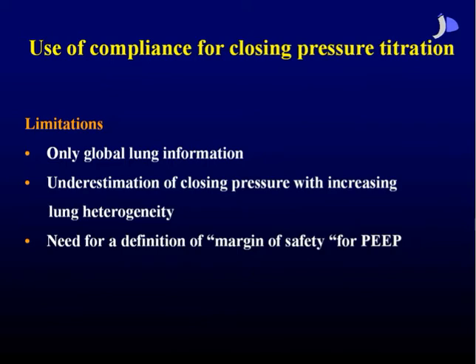But I think you have to do this in a protocolized manner. Set a specific protocol. How do you want to have your patient? How stable? What's the volume status? What is the cardiac performance? And then, when you have all this information, try to decide what recruitment strategy you want to apply.